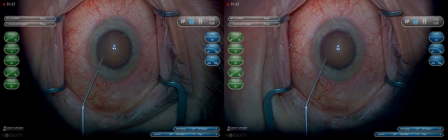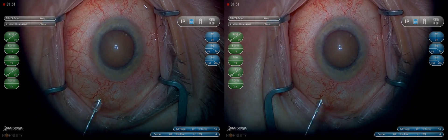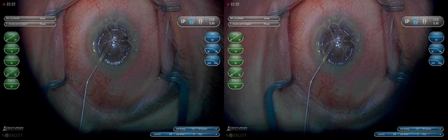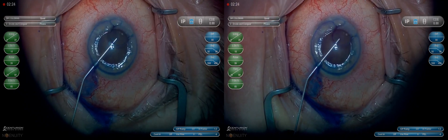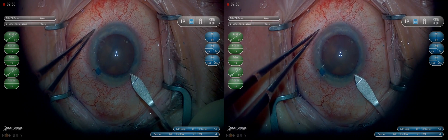We'll make our paracentesis about a half a millimeter anterior to the limbus. We can use the same cannula to draw air and fill the anterior chamber with air prior to using TriPan Blue to stain the capsule. We'll burp out with our viscoelastic the remaining TriPan Blue to get a good view.